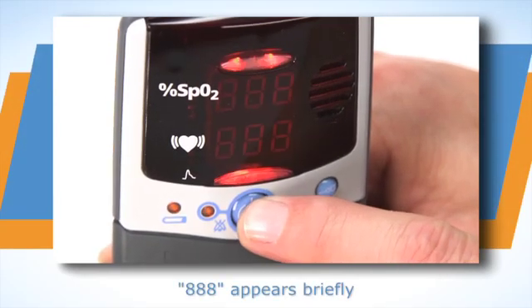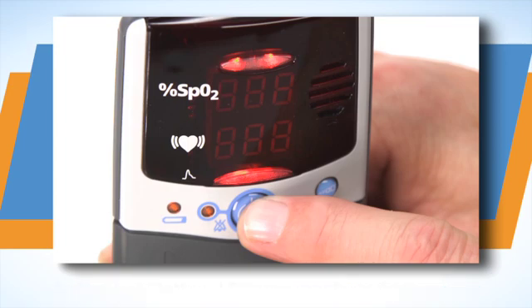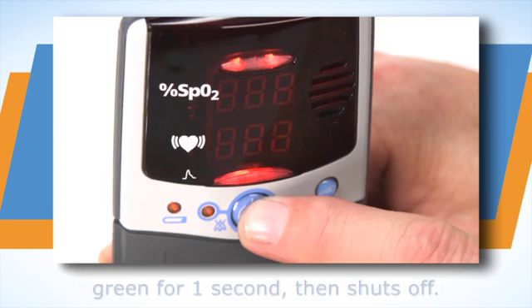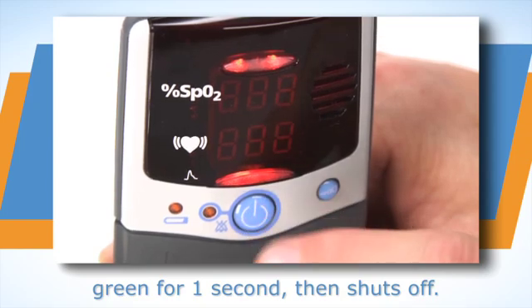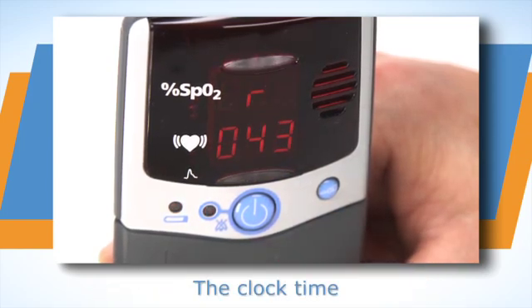Press the on-off button to start the unit. The oximeter will run through a power-up systems check as it turns on. Watch the systems check to ensure all the LED elements and information appear as shown here.